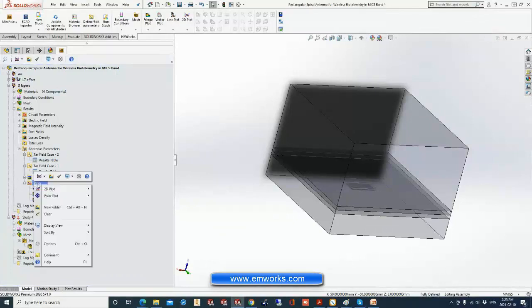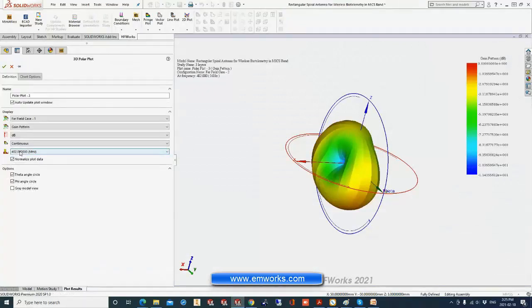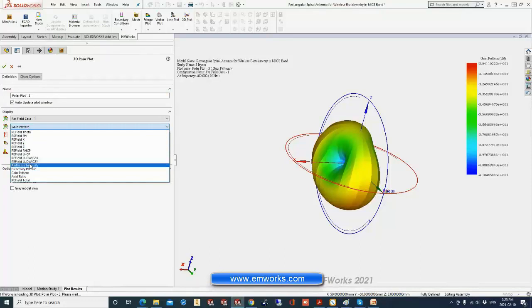So here we can right click, go to polar plot, 3D, and we can choose any parameter. For example, it can be the gain, it can be the radiation intensity, the E field in X, Y, Z direction. It can be the efficiency of the antenna versus frequency. So we can choose any parameter here.